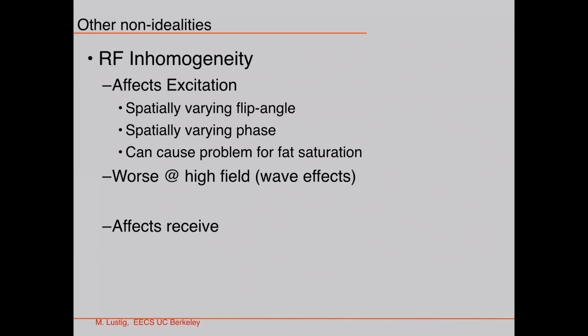Is that a big issue? Could be, but it depends, like anything that we do. Definitely the 180 can be a big issue, right? We wanted to refocus, but now it doesn't fully refocus in all places. So that's going to have signal dependency.